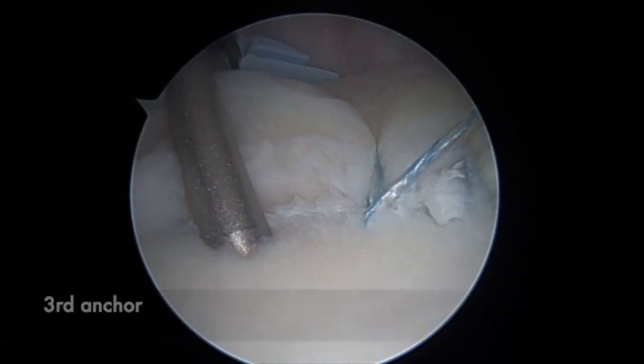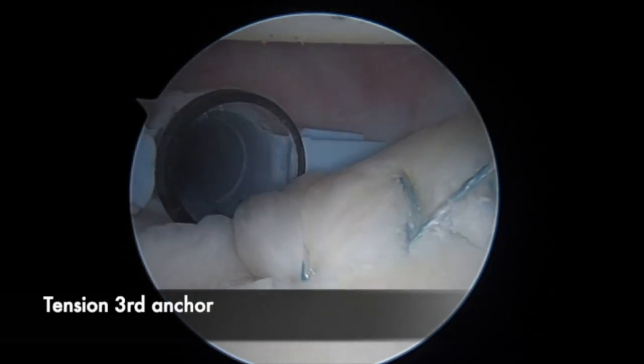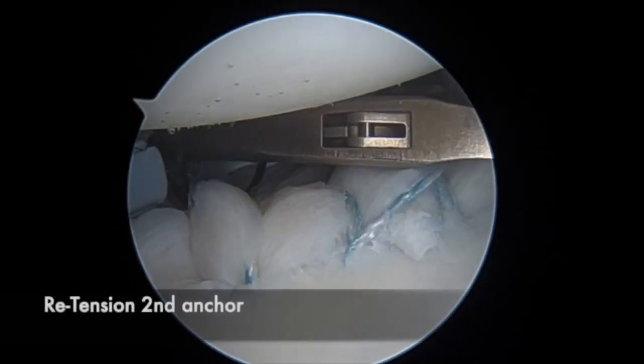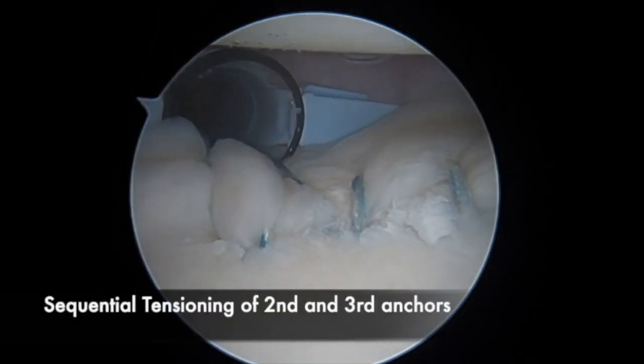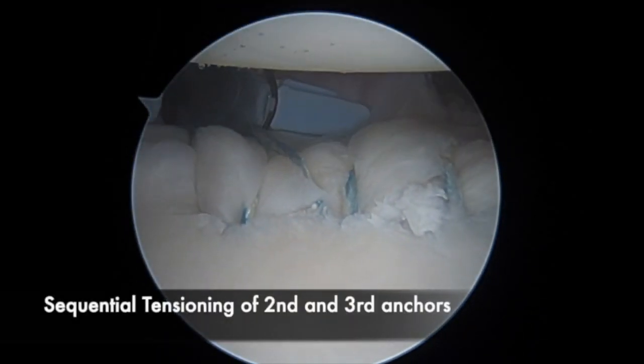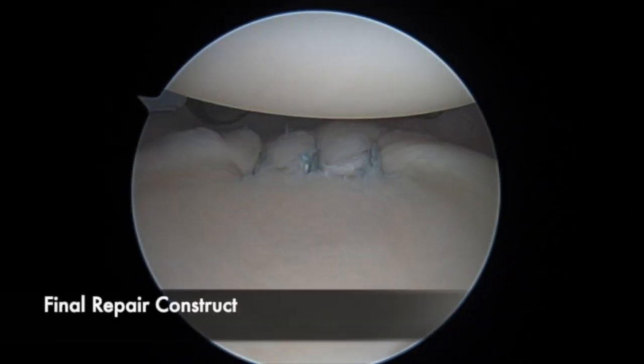Here, a three-anchor posterior labral repair has been performed, and we can see that by preserving the tensioning stitch from each anchor, we are able to go back and sequentially re-tension along for our appropriate restoration of a labral bumper. The sutures can then be cut flush, demonstrating the final repair construct.